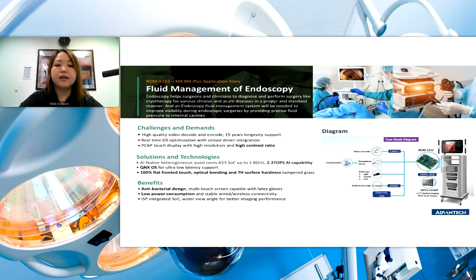The fluid management for the endoscopy will be needed, and it helps a lot, as during the endoscopic surgeries, the internal and the external surfaces will be exposed to body fluid. That is the time that we have to improve the visibility.